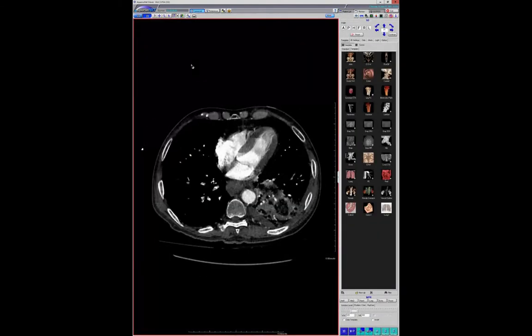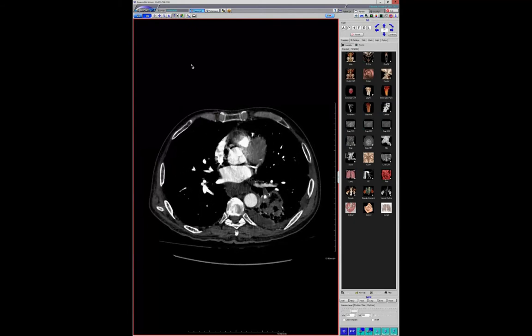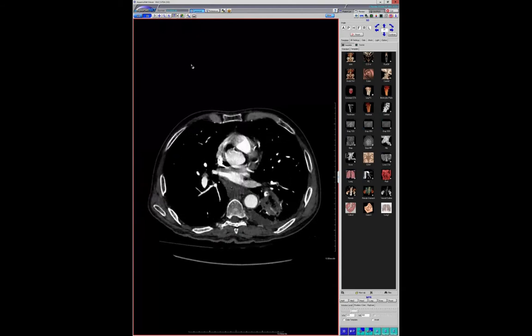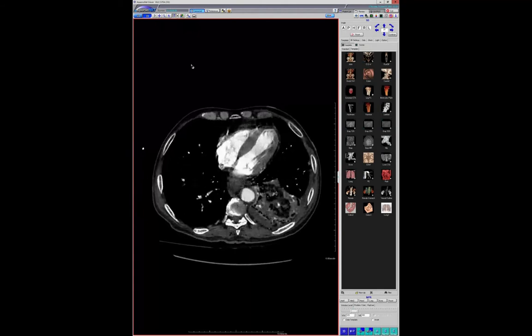Here's the other reason I really thought it was mucor. Look, there's a clot, which I thought was going to be local invasion right here. Oh yeah, I actually thought that was going to be mucor invading the vessel, but it's not. It was all staph. Cool. Thanks.